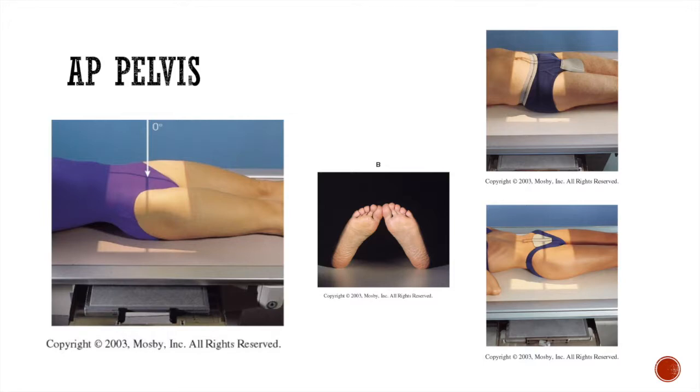and you also want to make sure to shield the abdomen, breast, and parts of the femur. Use the appropriate marker to mark whether it is the left or right side of the pelvis, and you want to collimate to 14 by 17 inches to the IR.